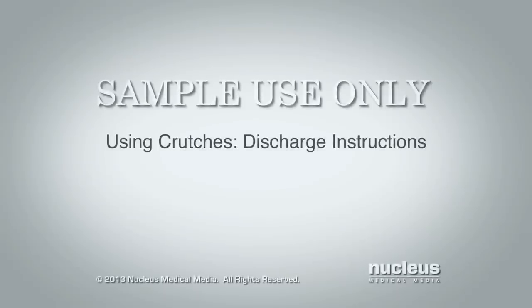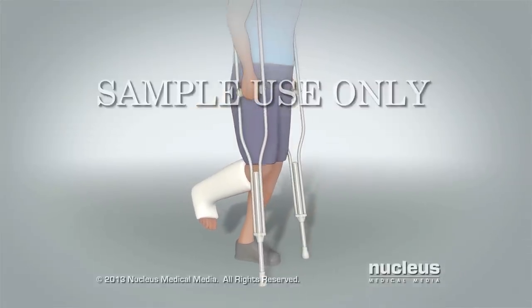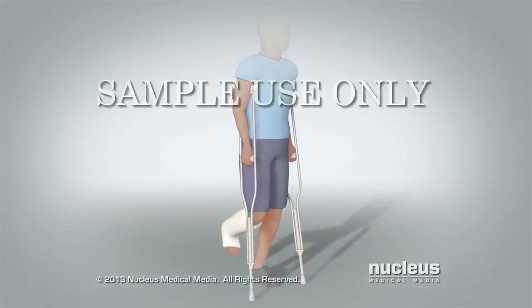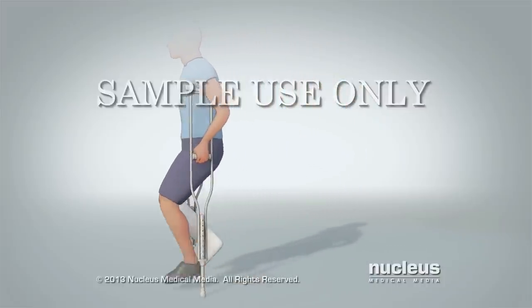This video will teach you how to use your crutches. Please watch the entire video before using your crutches. Crutches help you move around without having to put weight on your injured foot or leg. If you have had an injury to or an operation on your foot or leg, you may need to use crutches.